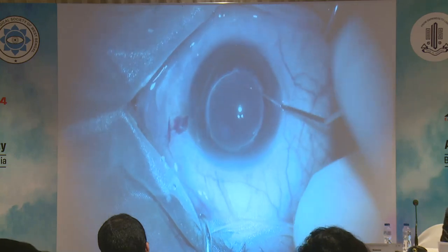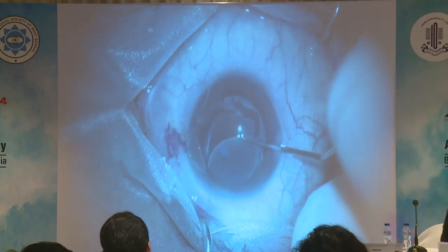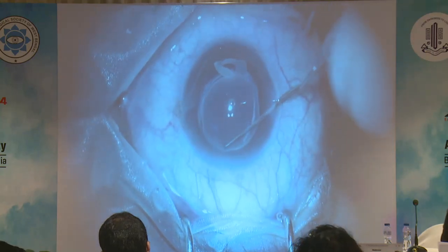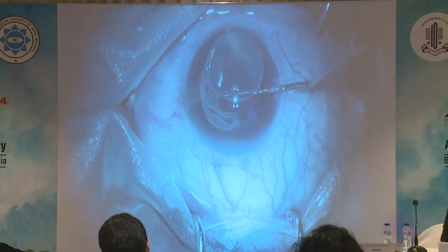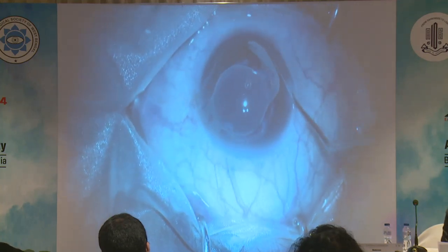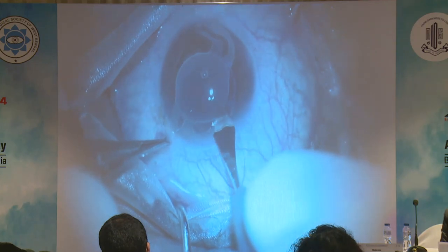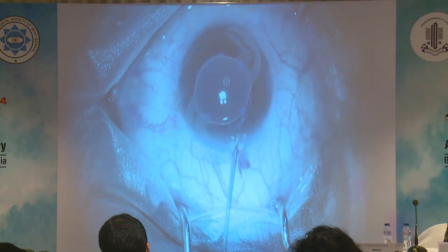Then I take a dialer, go into the capsular bag near the optic-haptic junction and gently try to pull the IOL out of the capsular bag. I repeat the same maneuver from the other side of the IOL. Yes, I am able to take the IOL out of the capsular bag. I construct the main port and inject dispersive viscoelastic.